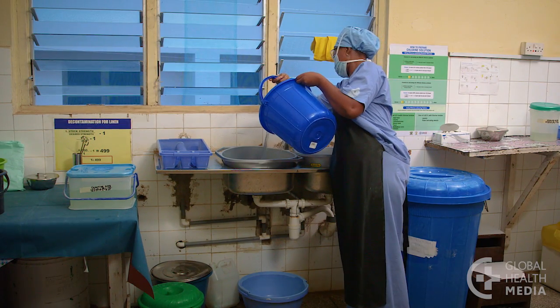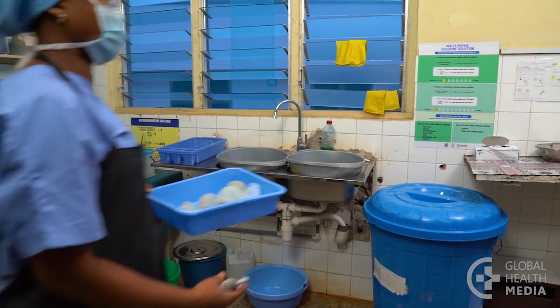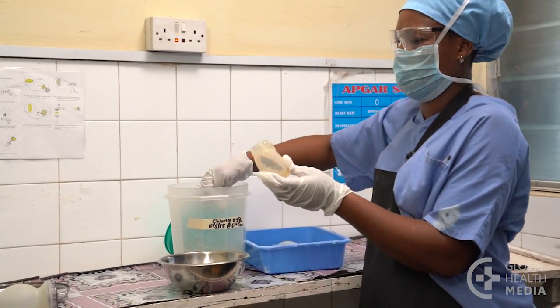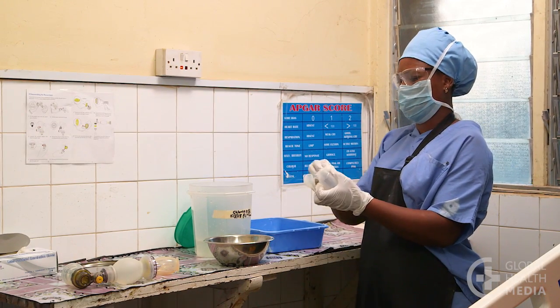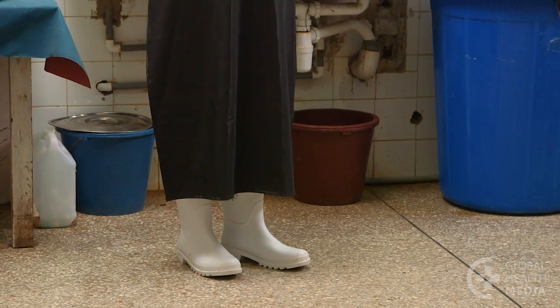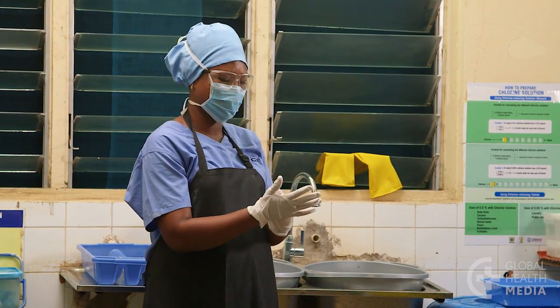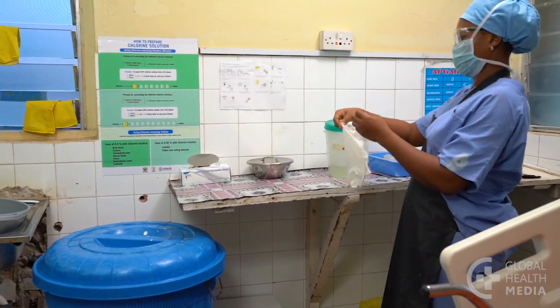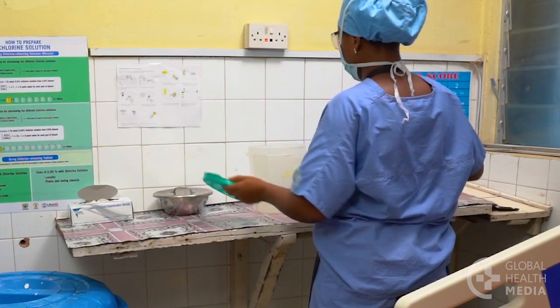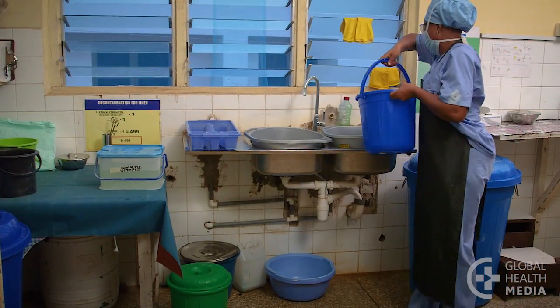The first step is preparation. Organize the room into a separate clean area and a dirty area. Wear protective clothing to protect yourself from harmful germs on the equipment and any splashes of chemical. You'll need boots, an apron, gloves, mask, eye protection, and a cap. You can wear clean exam gloves or utility gloves at this step. Prepare a solution of 0.5% chlorine and soapy water fresh each time you need to clean the equipment.